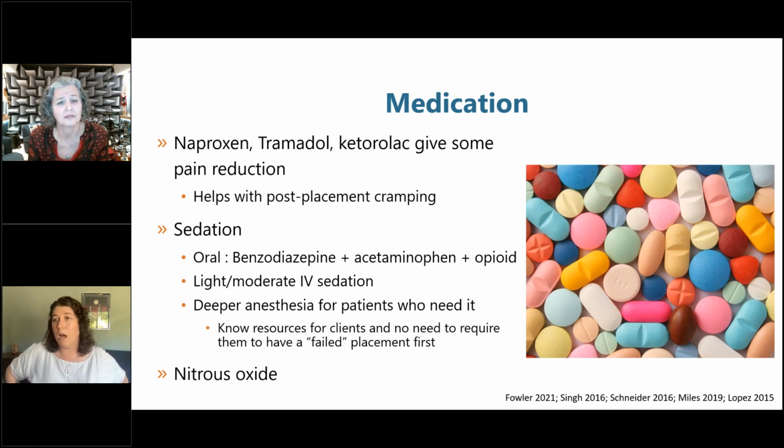Yep. A couple of questions have come in, like what about intracervical lidocaine if we can't do a paracervical? If that's the option you have, great. And same thing I mentioned at the beginning: if a client comes in and requests a pain management strategy that you are not able to provide, like a cervical block or more sedation than you can provide, the one thing this highlights is that it's important to know your resources.